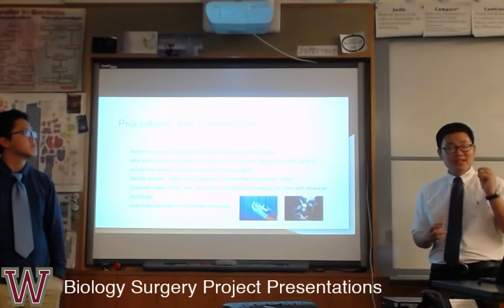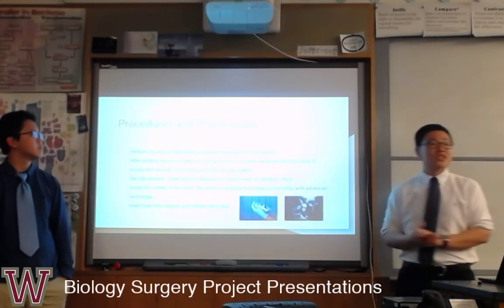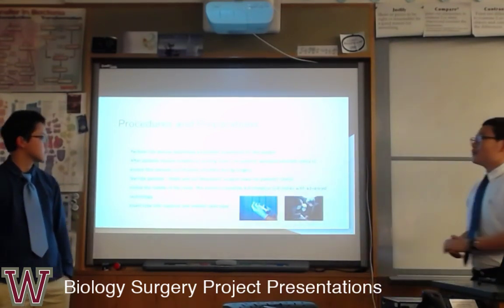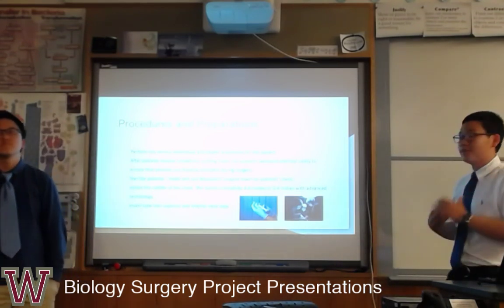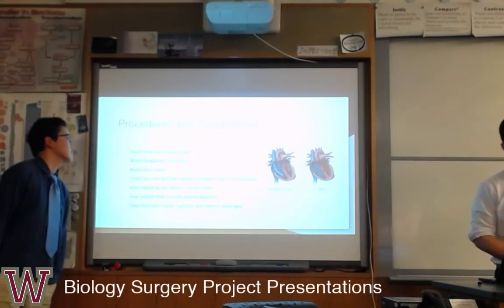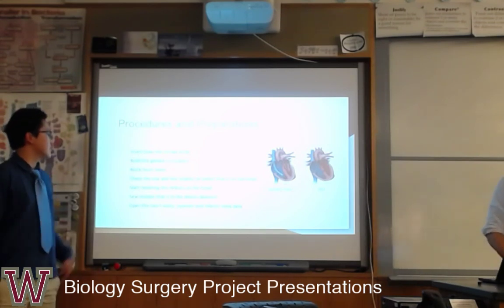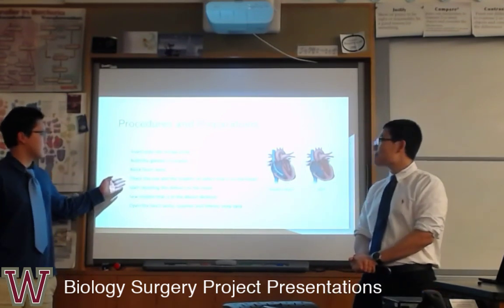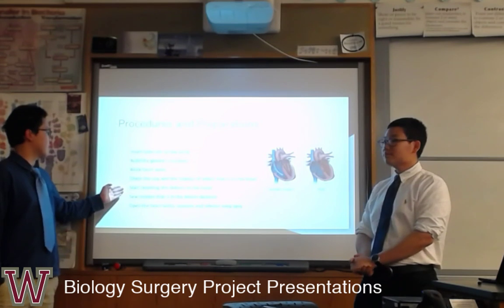The incision should be very, very small, like 2 to 4 inches, with now very advanced and developed technology. Doctors will insert tubes into the superior and inferior vena cava of the patient. The next step is to insert a tube into the aorta and build the general circulation, and then the doctor should block the heart aorta, check the size and location of the defect on the heart, and start repairing the defects on the heart.